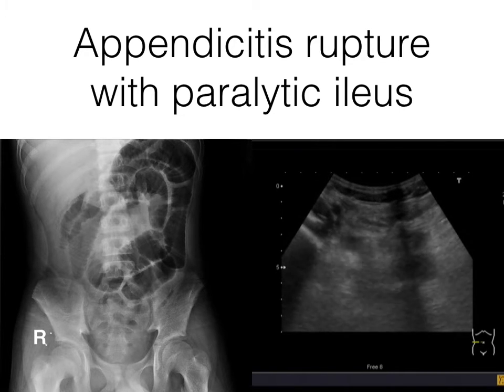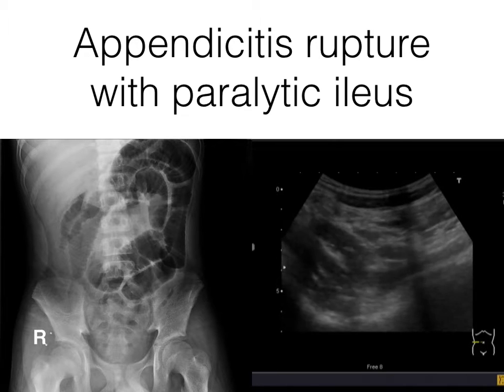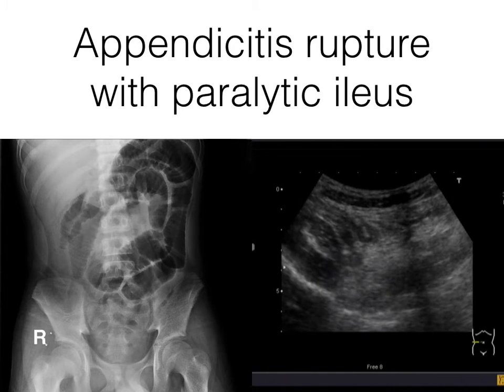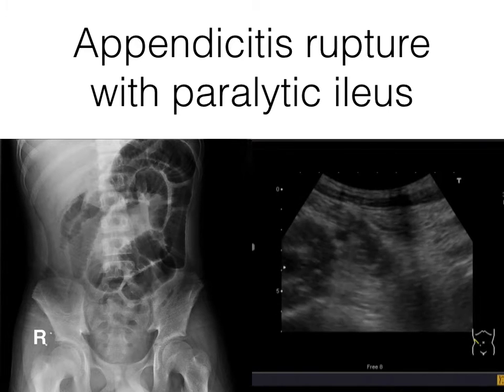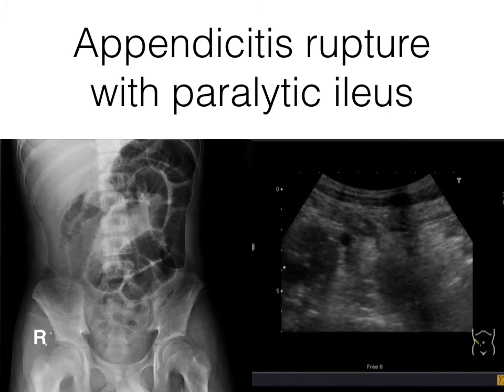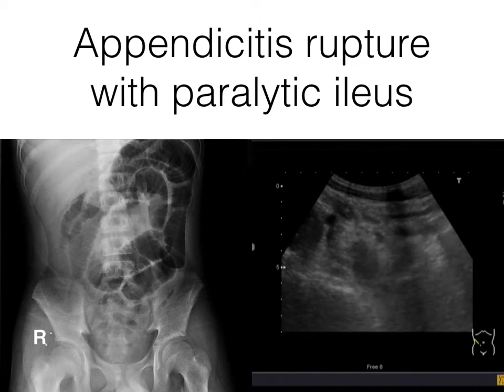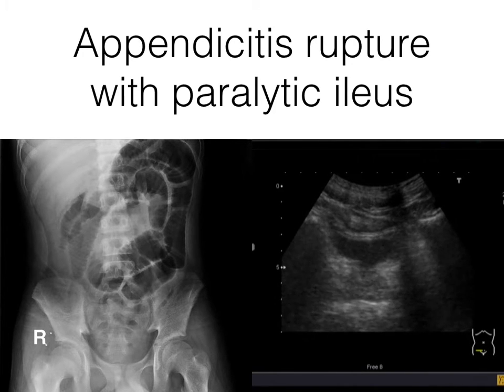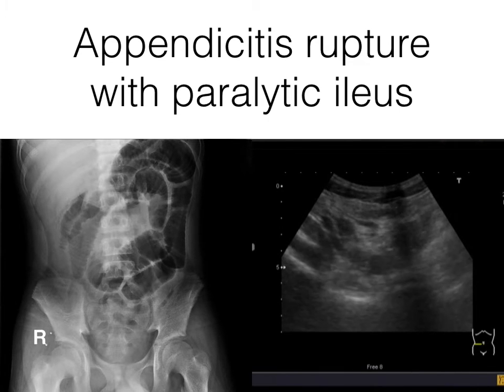ruptured appendicitis. So typical locations: iliac crest, psoas muscle, iliac vessels, and then we scan transversely, and you can see this one, but without an end. Why? Because it has ruptured into the peritoneum, so you cannot find an end. You can find blind-ended structures. You can find the base, and then downward is a lot of dirty fluid in the pelvis. That caused the patient's paralytic ileus here.